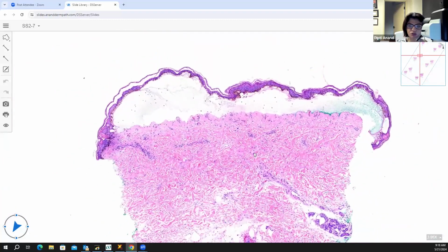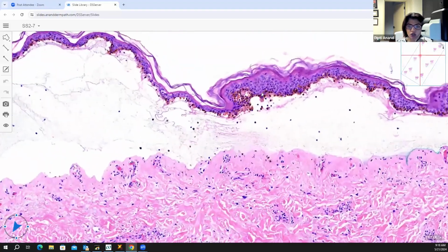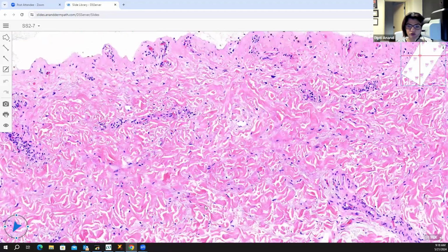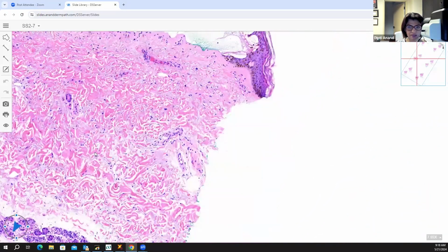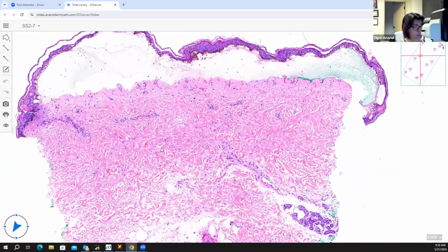When you see a cell poor subepidermal blister, a coma blister basically looks like a lacy epidermis, so epidermal necrosis. What you see in bullous EM or TEN, that's how it will look, but they have to give you the sweat glands to see the sweat gland necrosis, and the sweat glands look pretty normal in here. So the morphology doesn't go with the coma blister. This is a cell poor subepidermal blister.